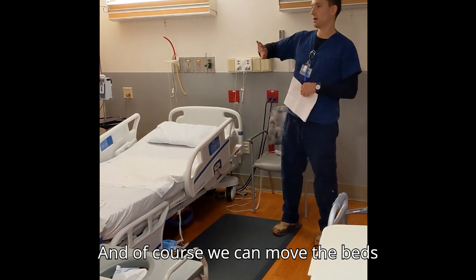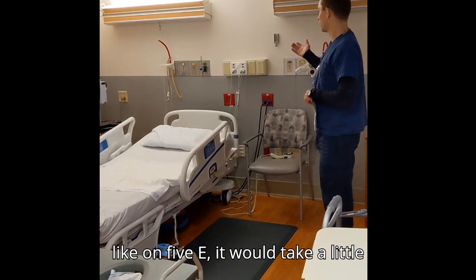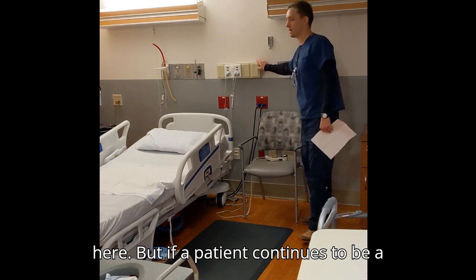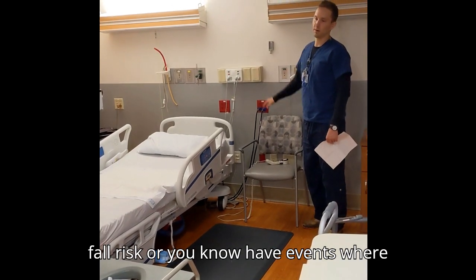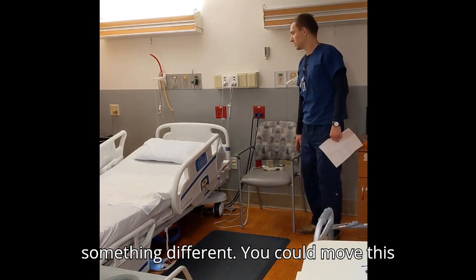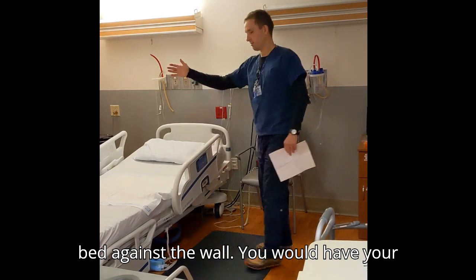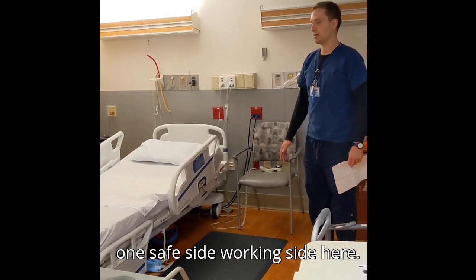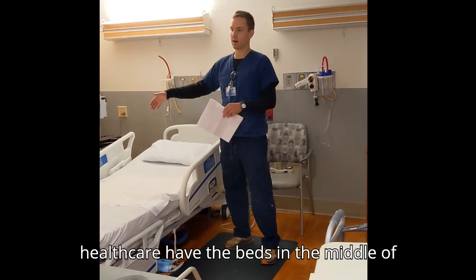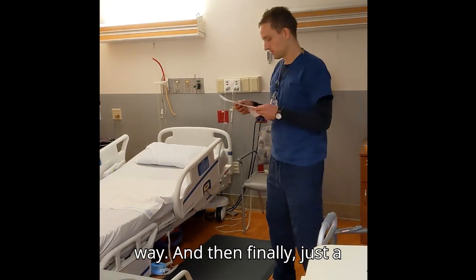And of course, we can move the beds against the wall. Up here, like on 5 East, it would take a little bit of maneuvering of all this equipment, but if a patient continues to be a fall risk or have events where we need to figure out something different, you could move this bed against the wall. You would have your one safe side, working side here. That's a consideration. We just tend to usually in healthcare have the beds in the middle of the room, but it doesn't have to be that way.